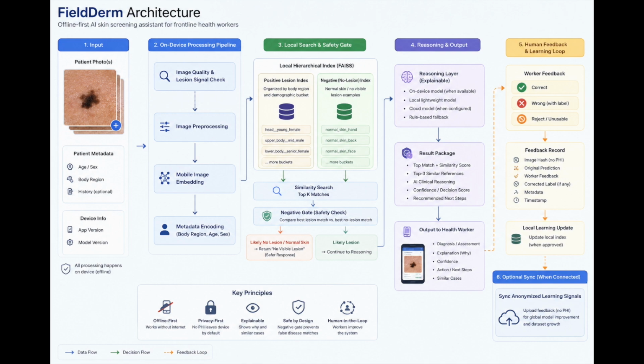If they find something wrong in a decision created by the model, they can reject it, and then we can sync the data to the model and re-index everything. That way, the more people use this application, the more accurate it becomes. The overall idea is to help health workers, because there are a lot of patients and fewer doctors available. They can diagnose and find the patients who need more help.